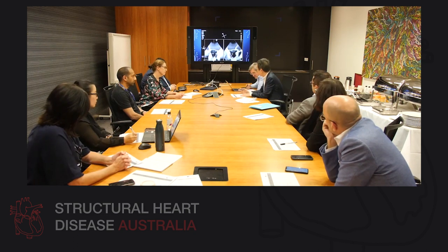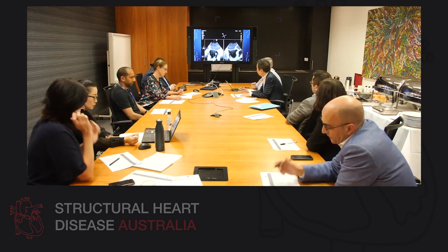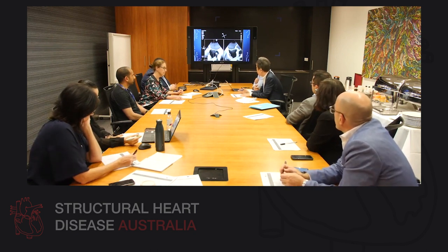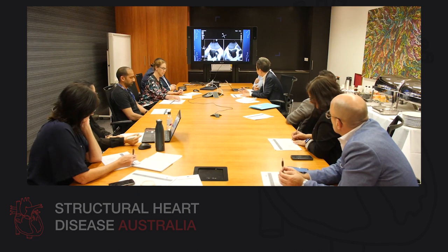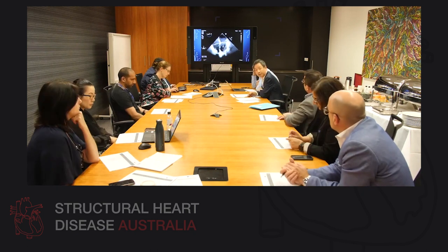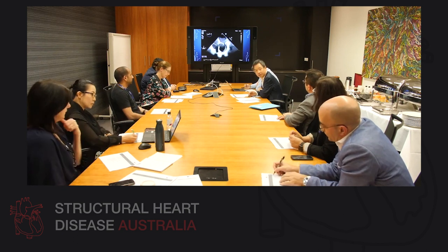The consensus here is that this patient has clinically significant mitral regurgitation, which is treatable by percutaneous mitral valve repair with an edge-to-edge repair device, either a MitraClip or an Edwards PASCAL implant. His MR is also surgically addressable, but this is less desirable in his case due to advanced age. I would say that he's on optimal guideline-directed medical therapy, but still having kind of NYHA class 2-3 symptomology. This is a good discussion.